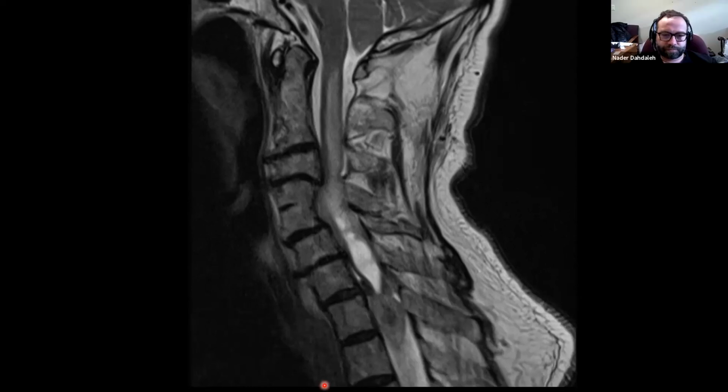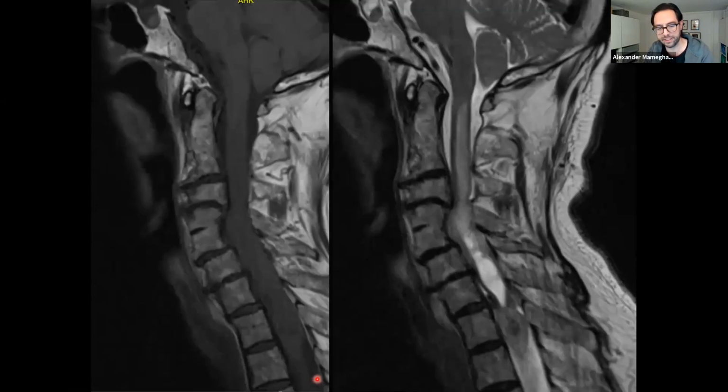Alex, there's one more thing. Is there also an acute disc there above the level of the mass ventrally? Whatever level that was, it isn't. I think it's a void. You can't find it in others. There was no disc herniation in these images. We can see it later on.